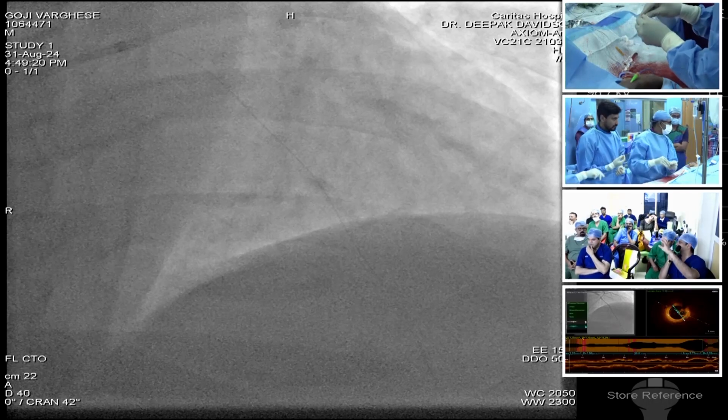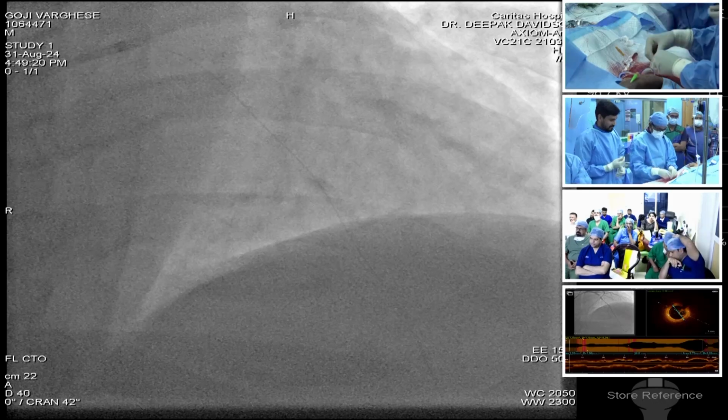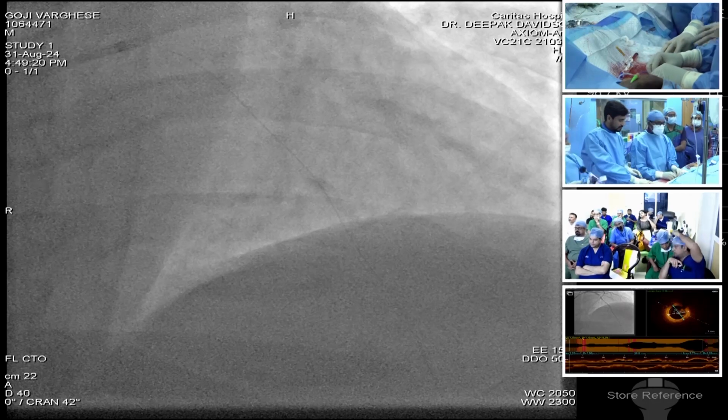Joji, 5 minutes. Be ready with the stent also. Negative. 2.75, 38.